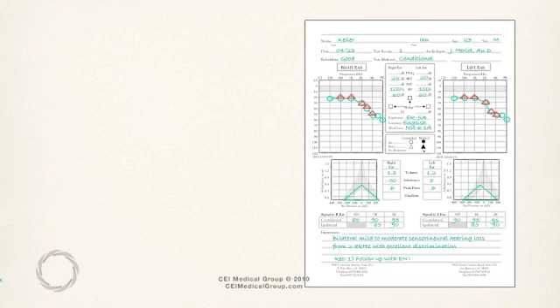By analyzing the type and degree of hearing loss, your audiologist and ENT will work together to determine the appropriate care for you, be it medical intervention or discussing amplification options such as hearing aids or FM systems.